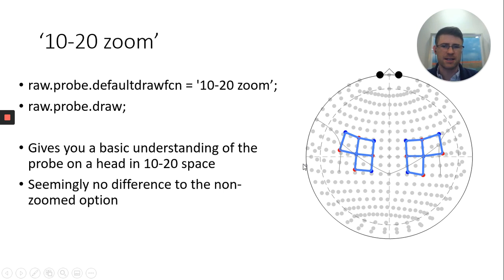You can also use 10-20 zoom, which I assume is supposed to zoom in on the probe, but I actually didn't see any difference between the two. So it doesn't seem to be too functional so far. Of course, it's probably a little simple swap in the code. So if this comes to light and it's useful, it might be easy to fix.